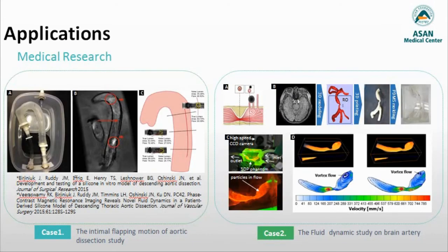For better understanding of complex pathologies, a variety of in vitro and ex vivo studies have investigated phantoms fabricated by 3D printing. These tangible 3D printing phantoms by themselves provide much more intuitive information than mere 3D visualizations.